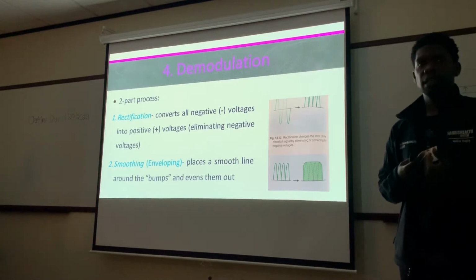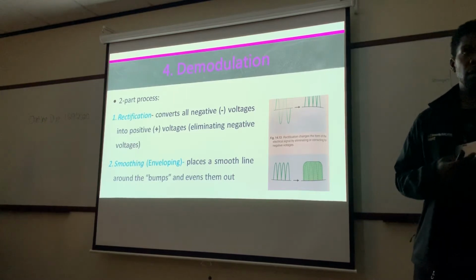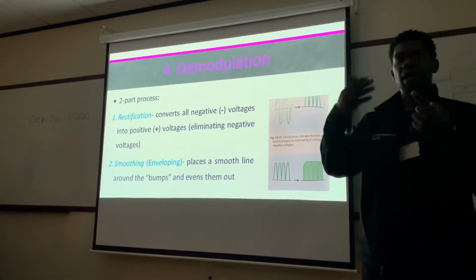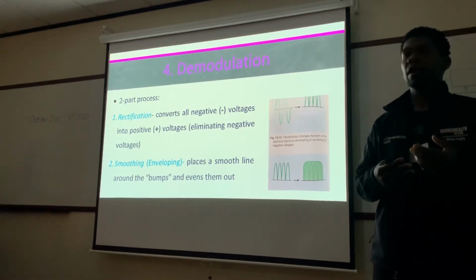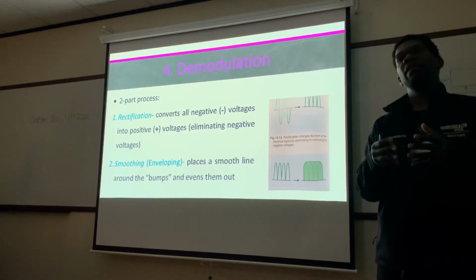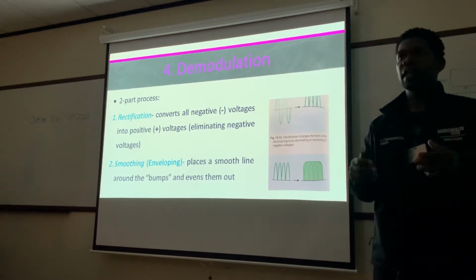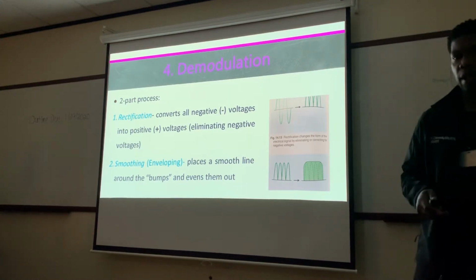Demodulation. Remember those two parts. Rectification, turning all the negative signals into positive signals, and smoothing or enveloping. Taking all of those positive signals and putting a line around them, so we have an element of consistency within our signal. Trying to summarize that up for you guys.